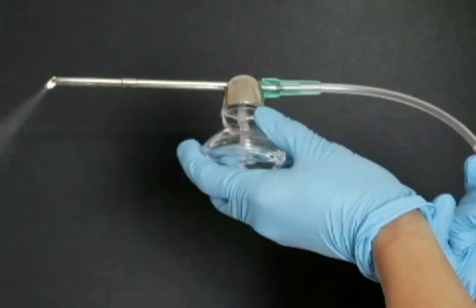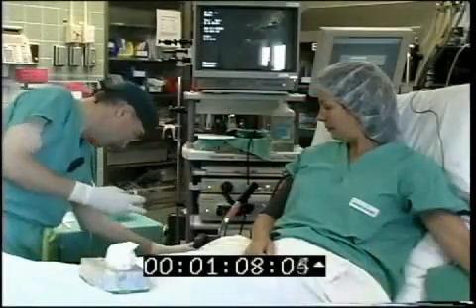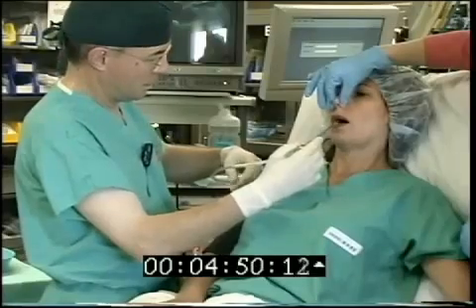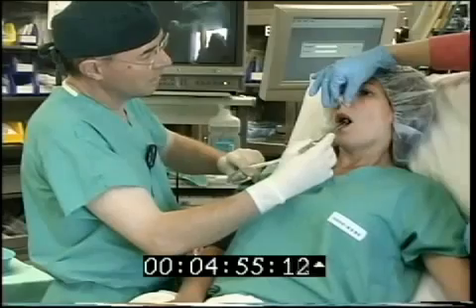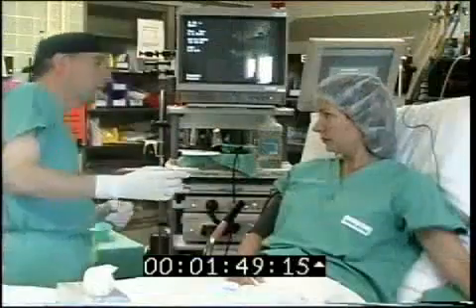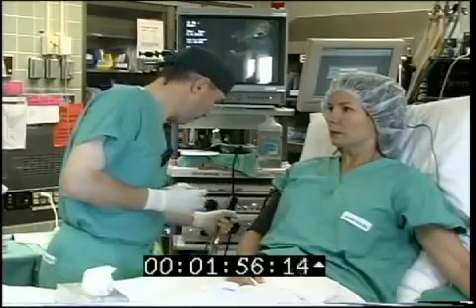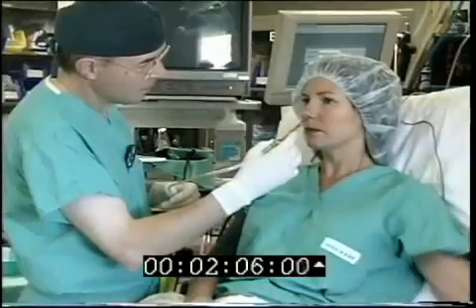This is followed by the use of a DeVilbis atomizer attached to oxygen tubing with 8 liters per minute of oxygen flow. The DeVilbis atomizer is filled with 12 mL of 3% lidocaine using 4% lidocaine solution diluted with water. The patient's cooperation with respiratory effort is essential while using the DeVilbis atomizer. If nasal tracheal intubation is anticipated, the application of the local anesthetic should begin with the selected nostril. The DeVilbis atomizer is applied with the patient's breathing in a coordinated fashion as shown in this video.